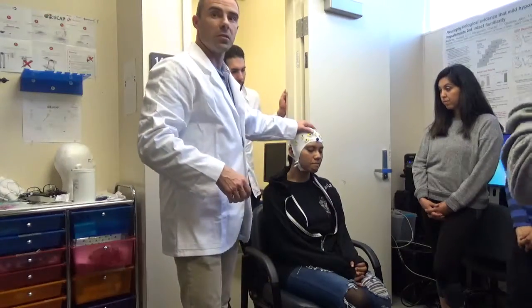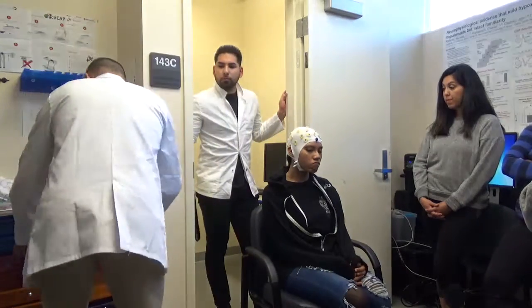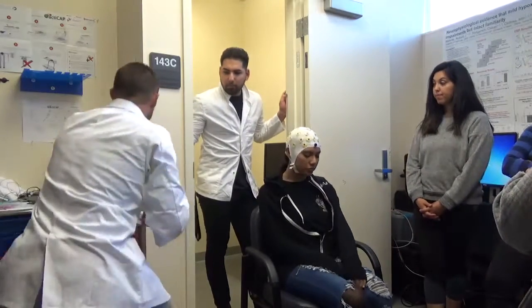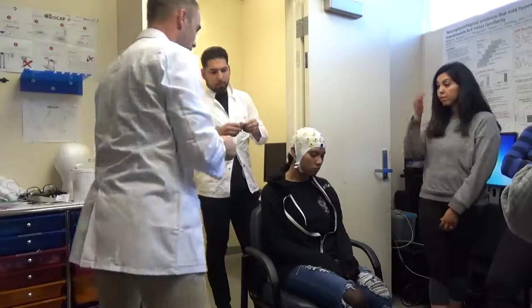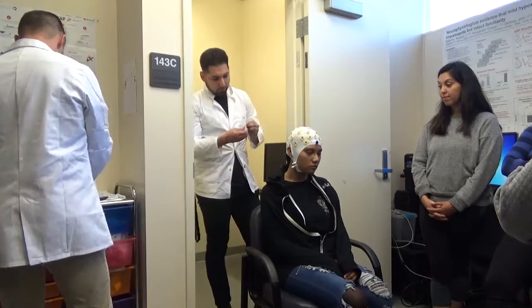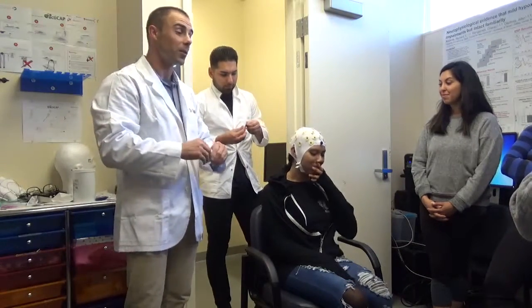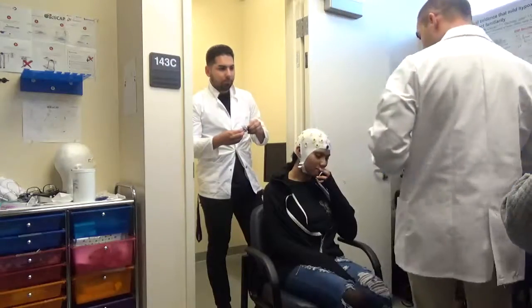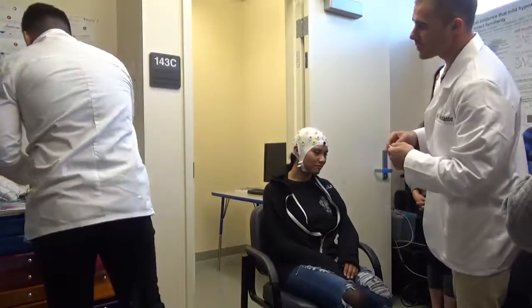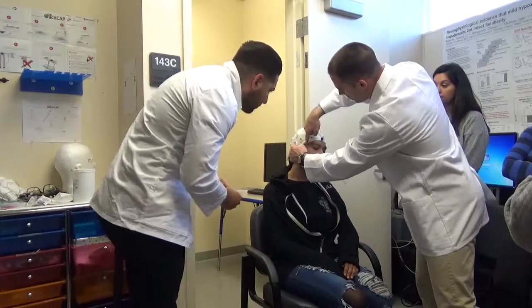Now that we have this here, we'll put some of the eye electrodes on. So what we'll do is, I'm going to grab a little swab. Do you want to open it? Oh yeah. And you want to remember our story. You want to tell them, "Hey, I am about to do this." Okay. It might feel a little cold. It'll otherwise be okay. And you want to use those sights. So on your side, you can lift that up and put it essentially there.